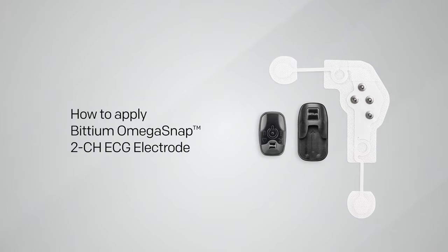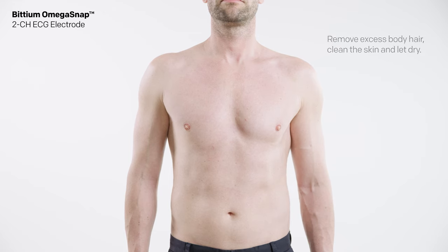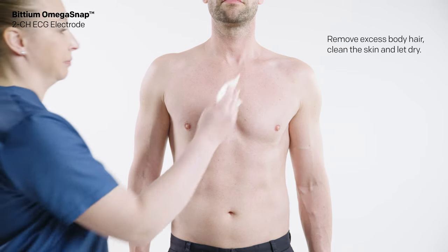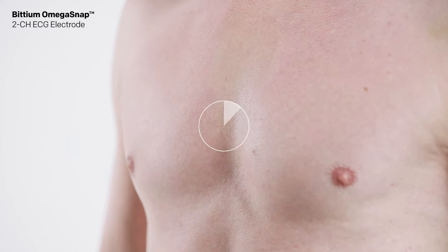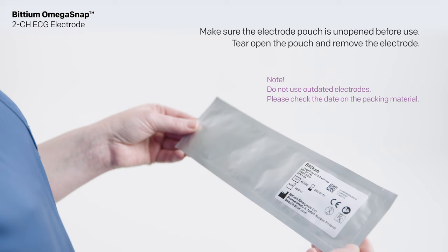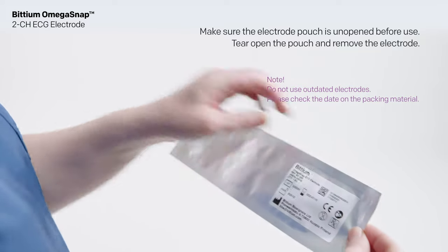How to apply the Bitium Omega Snap two-channel ECG electrode: if needed, remove excess body hair using a razor or an electric shaver. Clean the skin according to the instructions given by your clinic or the person responsible for treatment. The skin should be clean and dry when attaching the electrode. Make sure the electrode pouch is unopened before use.